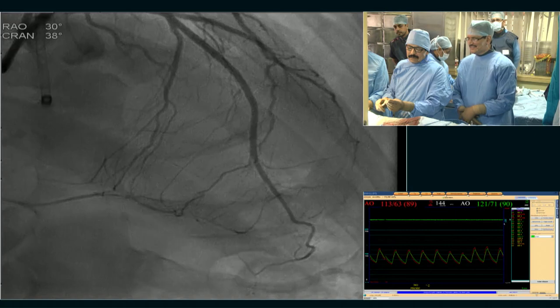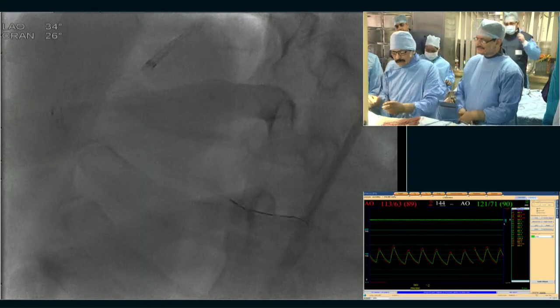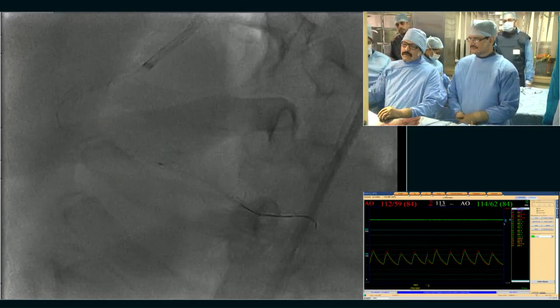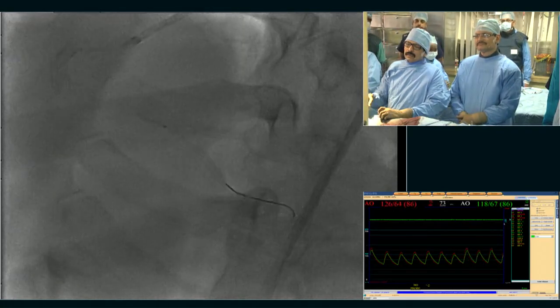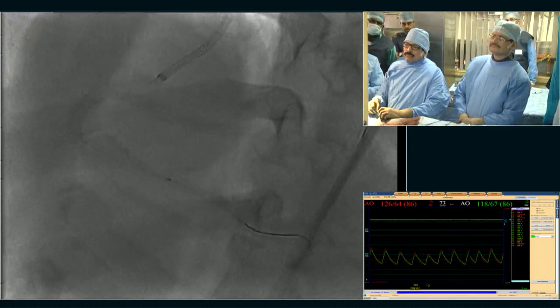Normally in this situation, I like to start with the Ultimate Bros 3. This is a very good wire for dual lumen crossing of a side branch. It has intermediate stiffness and good control, and I think that's much better than a stiffer wire that can go outside and cause perforation. And I think that very soft wires in this case are not so useful because they prolapse.